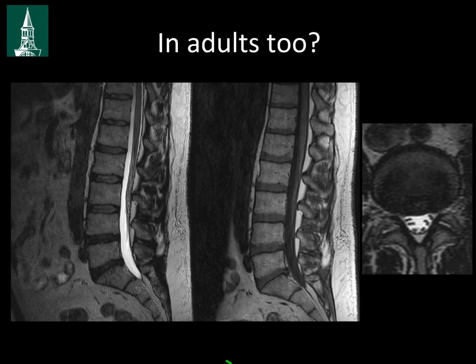So what I think is sort of the next thing, and I'm always pushing Frank on this a little bit, is I really think that what we should be doing is trying to push this technology out to adults. Obviously, we don't do a lot of pediatric spine. Nobody does unless you're at a children's hospital. We have these patients 1 or 2 a week where we might do a total spine. But we do a ton of adult lumbar spines and cervical spines. Every day we're doing 20, 30 of these exams.